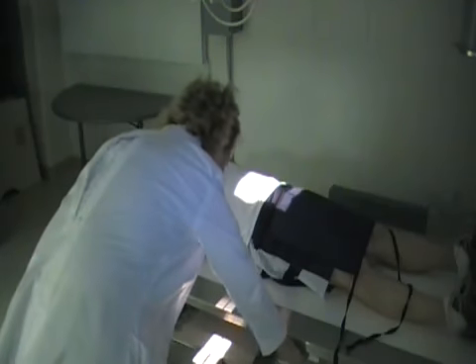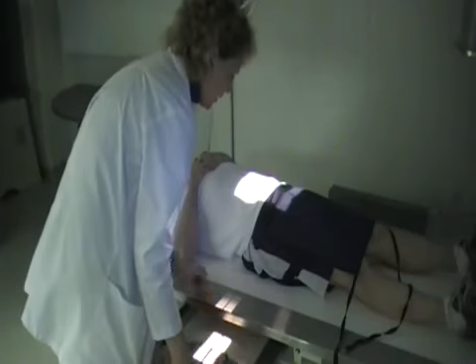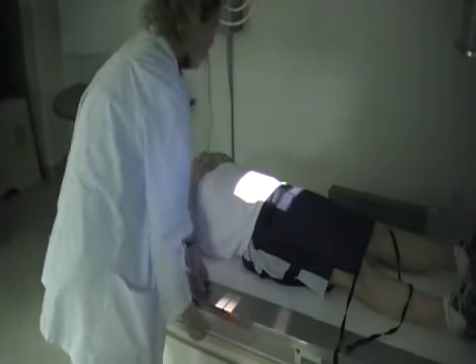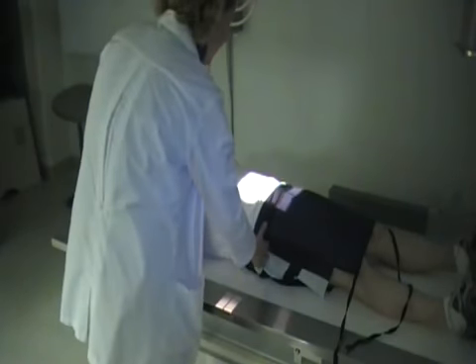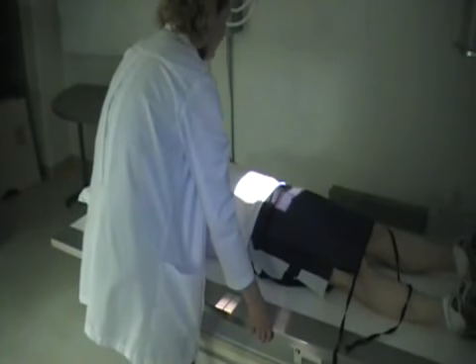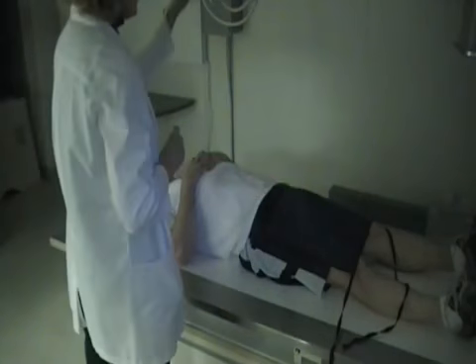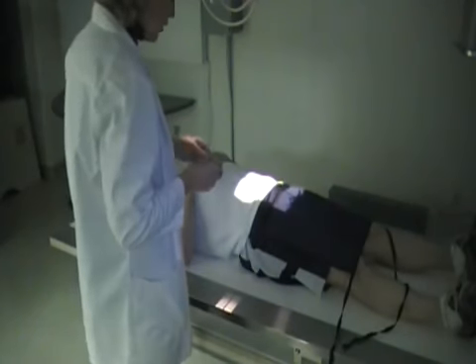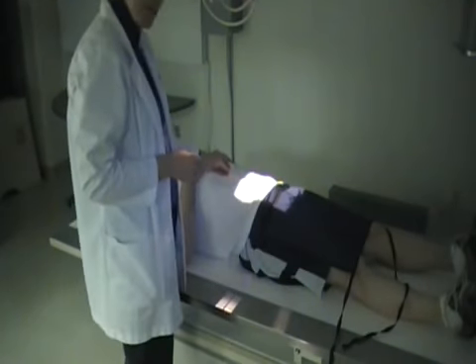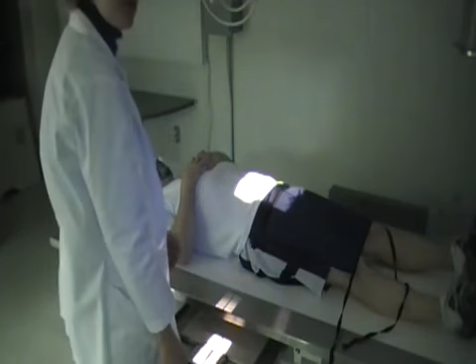Now just remember, whenever you change that tube angle, you always want to change where the bucky's at. Okay, so again, just double check where your pubic symphysis is, and then your central ray is going to enter 2 inches above that. Again, you want to mark the correct side of the patient, so you can either put a right marker there or put the right marker on the image receptor.